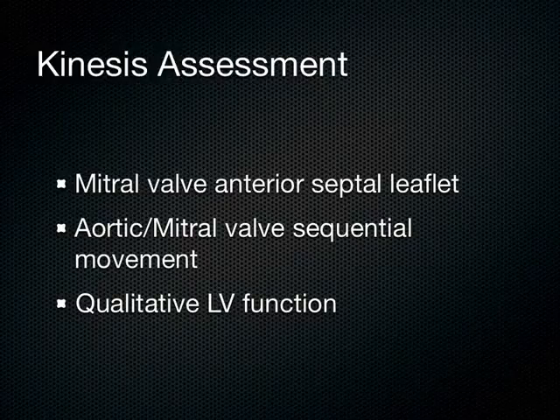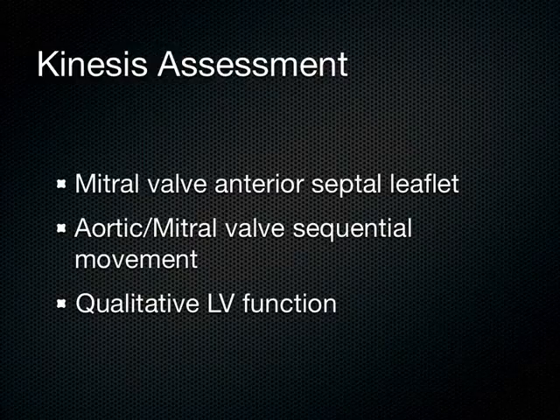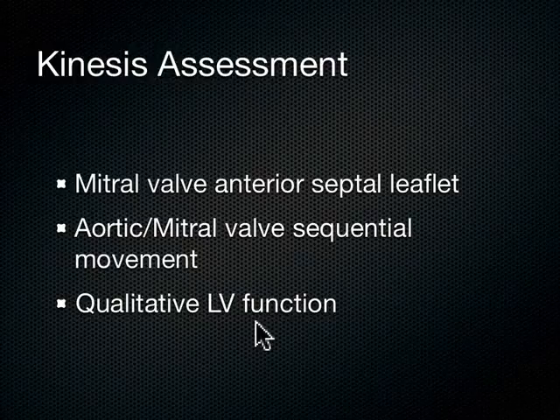Okay? Kinesis. I've got a patient who's hypotensive. Do I give them fluids or pressors? That's kind of like my first branch point in my head when I've got a patient with hypotension. And I can help that branch point one way or the other using this kinesis assessment.